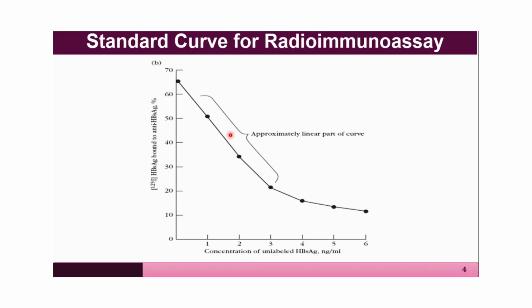When the antigens are in low concentration, at nanomolar level, the radioimmunoassay can be performed with appropriate dilution of the serum sample. With trial and error, one can achieve the range shown here in the curve on the linear part, and then one can find out the concentration of the antigen in the unknown sample by comparing it with the radiation shown by the radioisotope bound antigen.